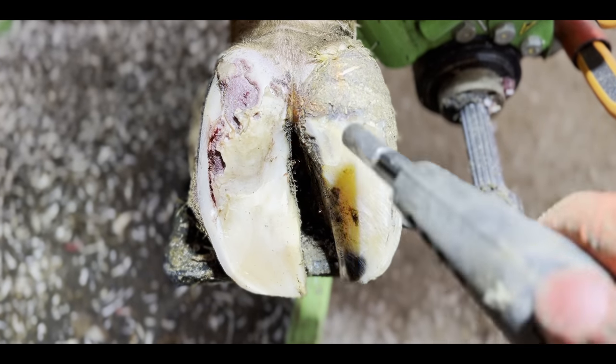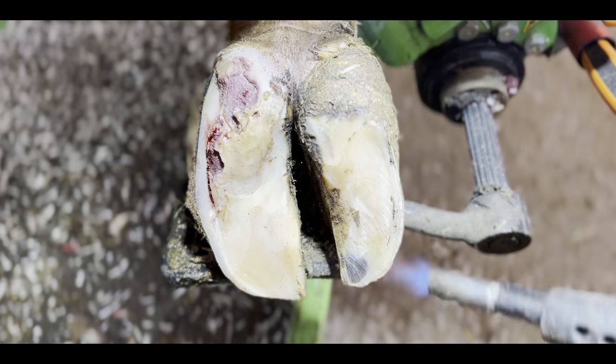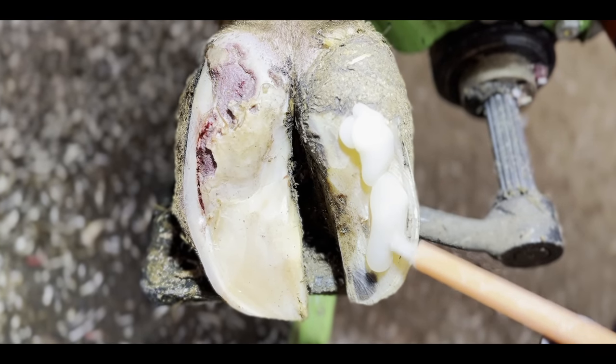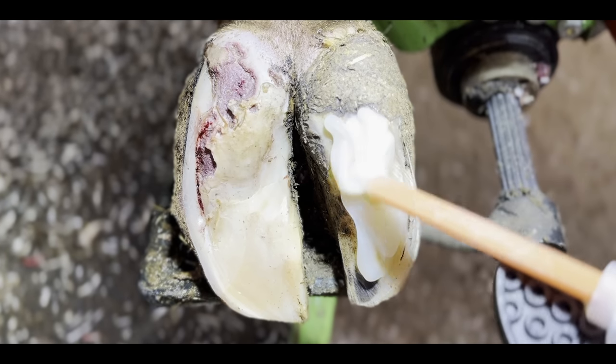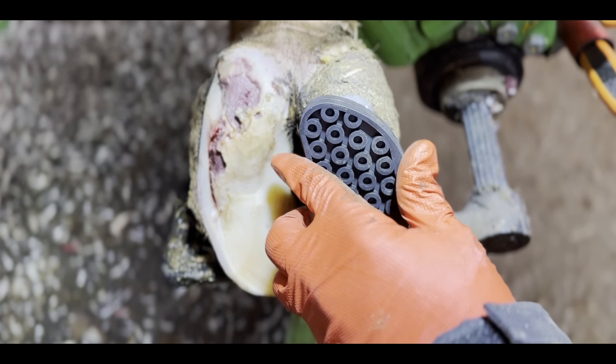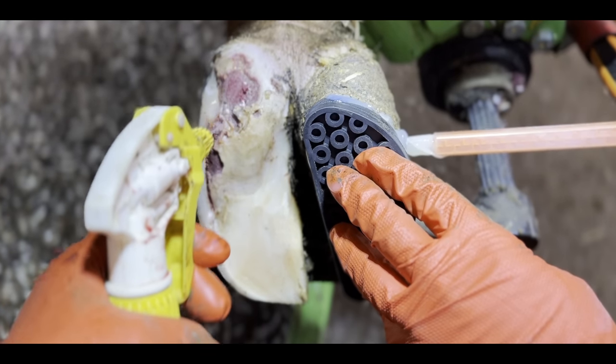We can reverse that inflammation by taking all of the stresses away from the affected digit, which is exactly what Bovibond is helping us to do here. We're applying a block using a two-part epoxy resin that is incredibly strong. That block will take all of the cow's weight while hopefully that lesion begins to heal.